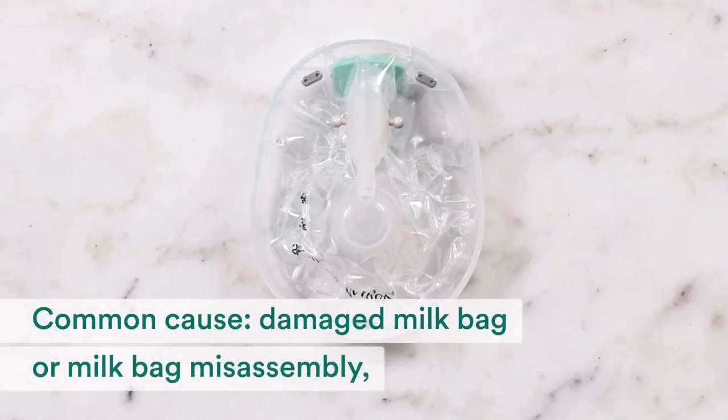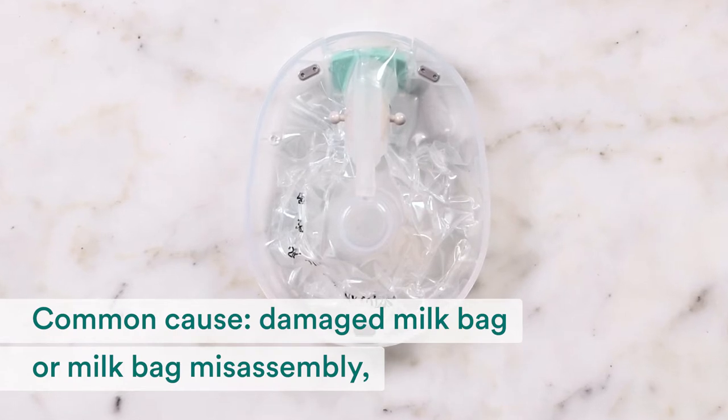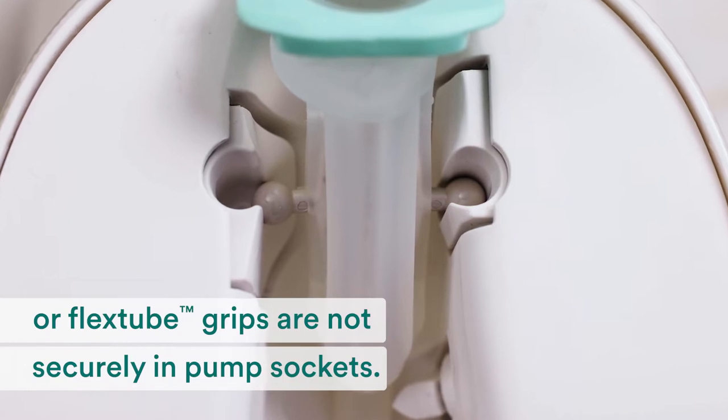The most common causes for an orange blinking light when using a milk bag are a damaged bag, misassembly to the flange, or the flex tube grips not being securely in the pump sockets.